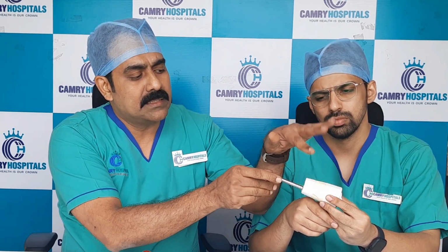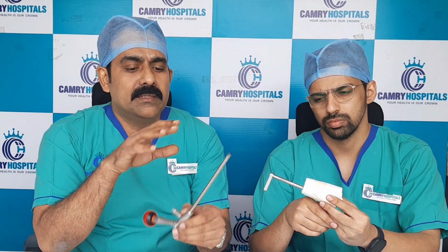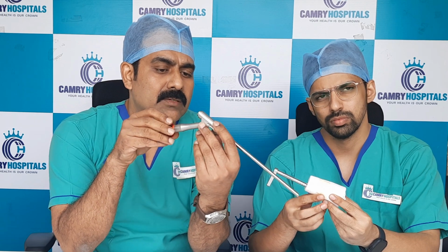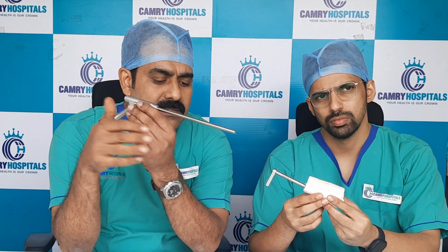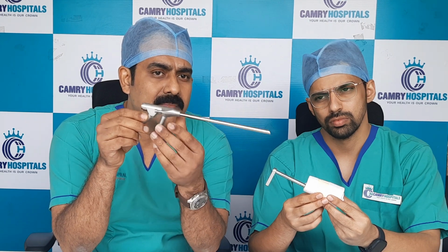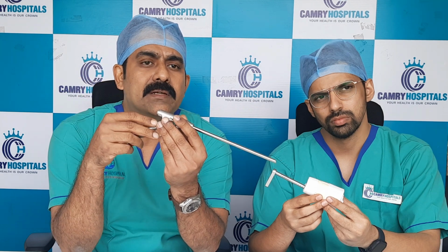Once the position is confirmed, with the tube inside we can adjust the position, upper side, lower side or midline. Then we will take the scope. This is called the single portal single channel scope. All the instruments and the scope are German made, precise instrumentation. This gives 60 times magnification.